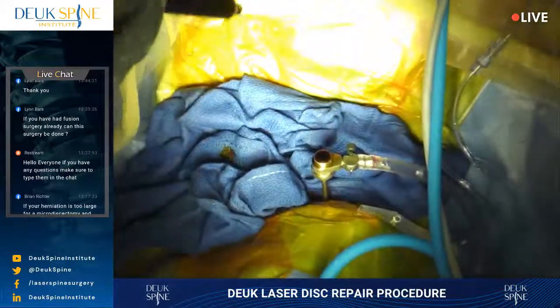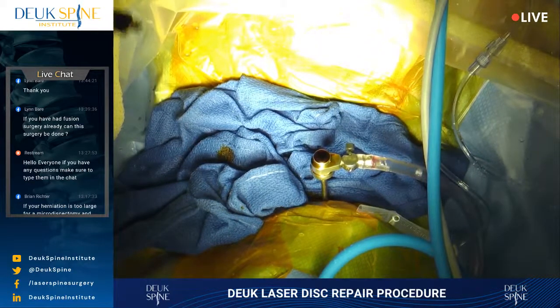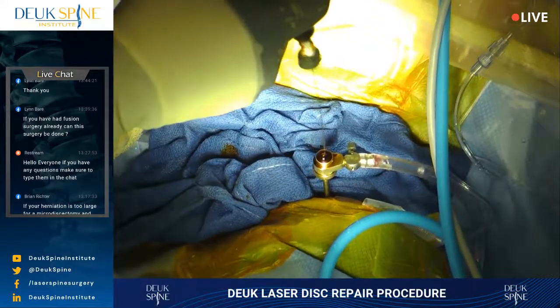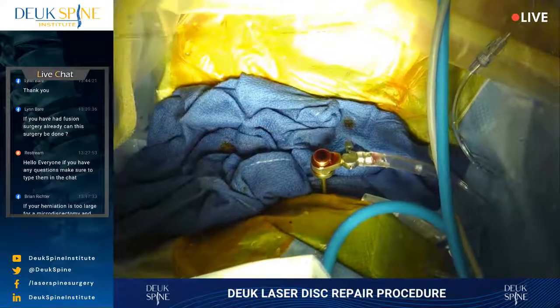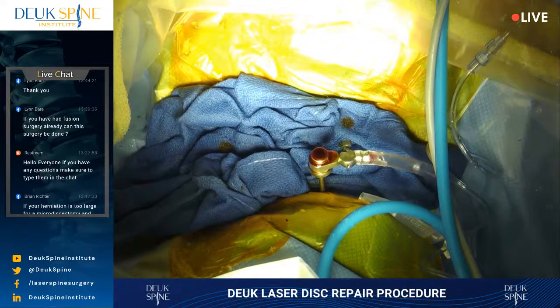Where's my needle? Questions? So, Diego, if there's no questions, why don't you run a video real quick on the cervical Deuk laser disc repair procedure. This is kind of a narrow needle. It's too narrow. It should be saved for the discogram.